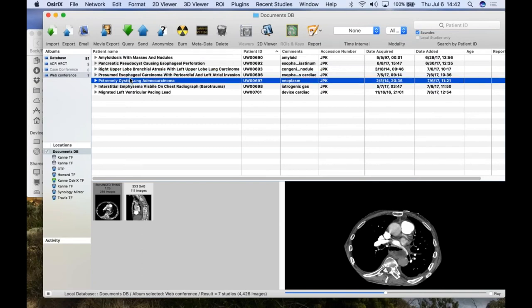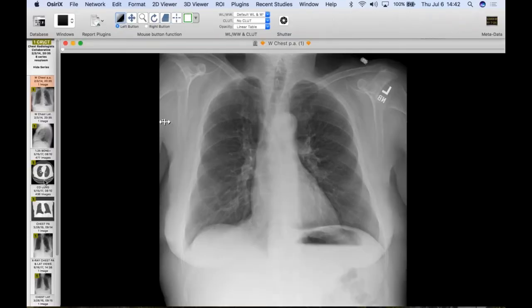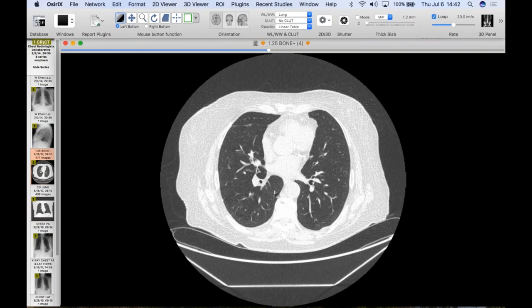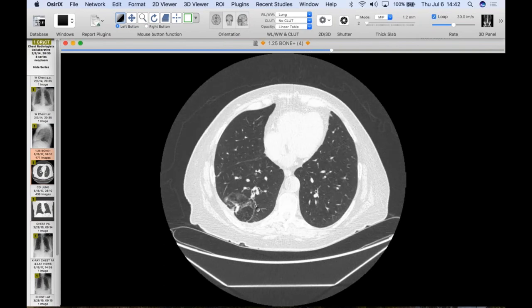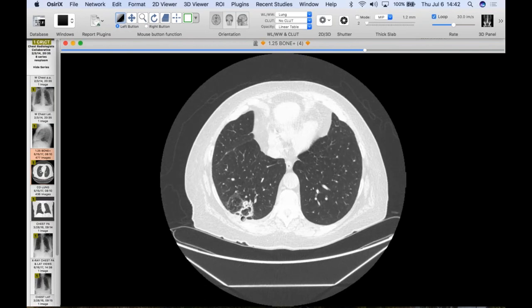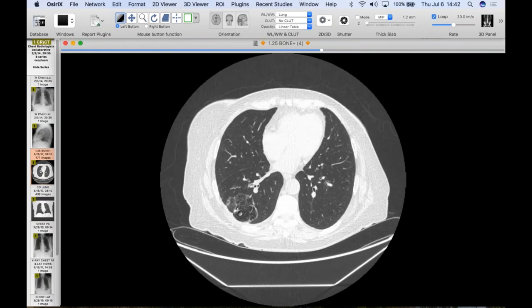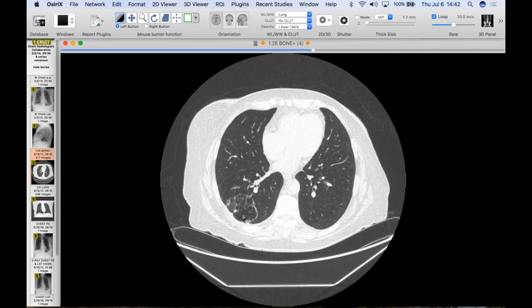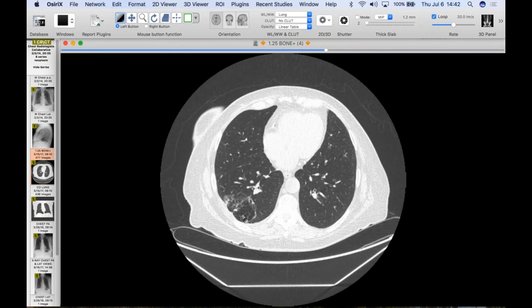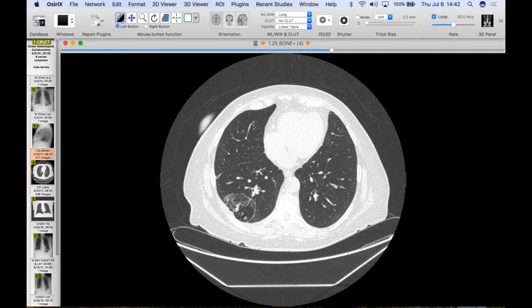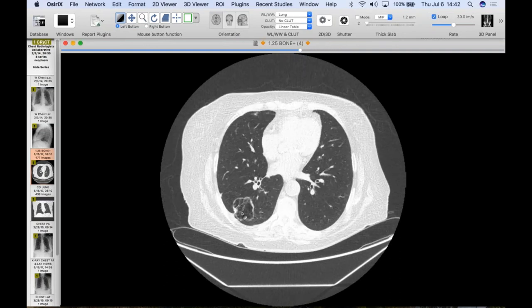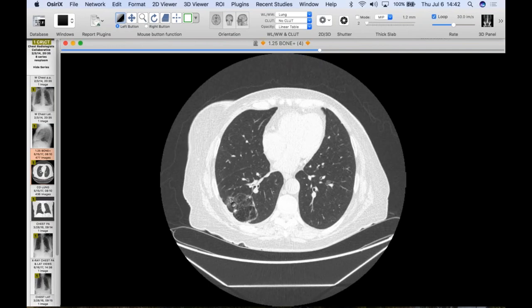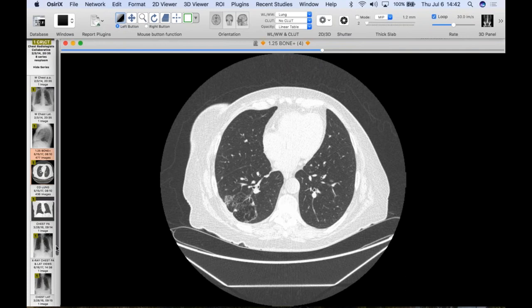On the sagittal, you can see a nice filling defect in the left atrium. This is essentially a contained rupture with pericardial enhancement, gas tracking, and this very unhappy-looking esophagus invading the left atrium. I don't think much can be done - maybe put a stent across it, but it's obviously a very tenuous situation. This companion case to Howard's: a smoker had a CT and this very bubbly lesion was identified. It does have a little bit of a solid rind and a solid component, and this is a proven adenocarcinoma on needle biopsy.